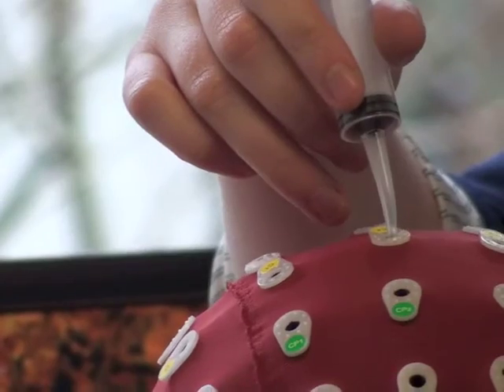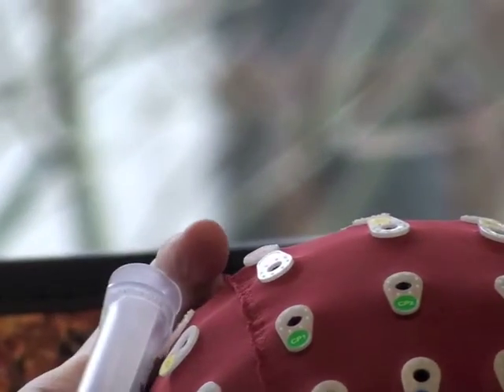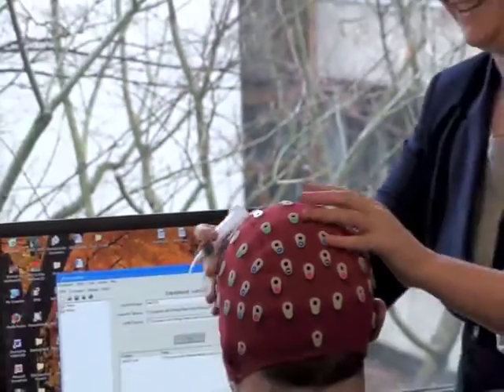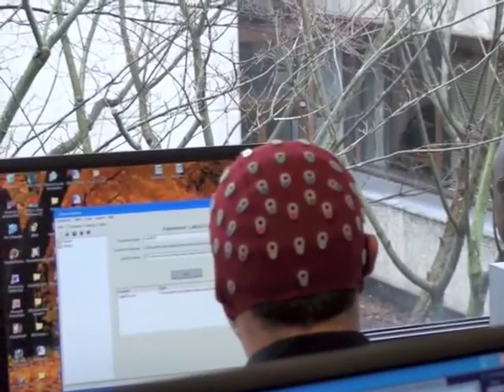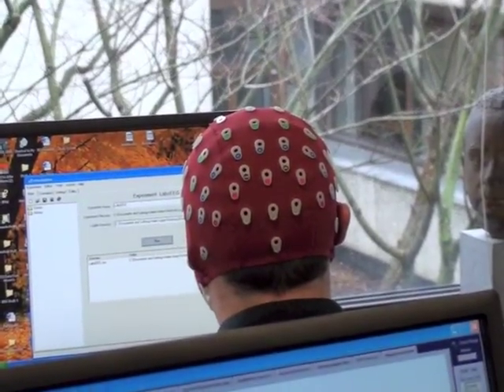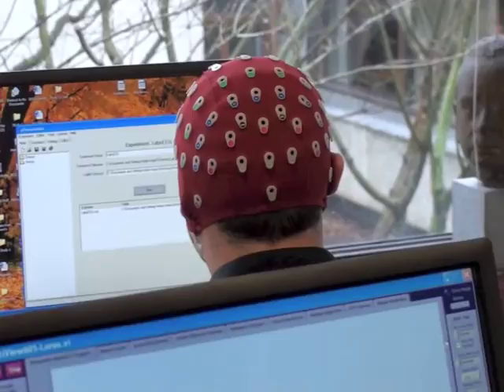So I should move it to the right? Move it to the left a little. Just left? A tiny bit. Yeah, my left. Okay, hold on. Yeah, that seems better? Yeah, fine. Okay, so that's fine. There's plenty more tips on the internet about how to best locate that.